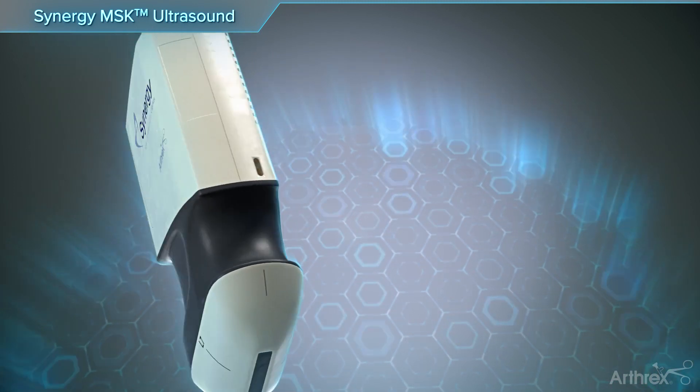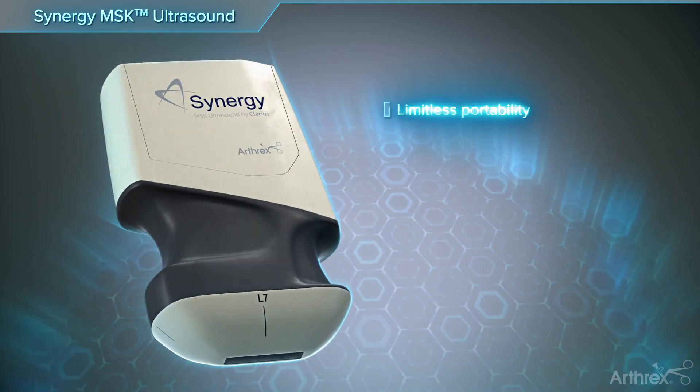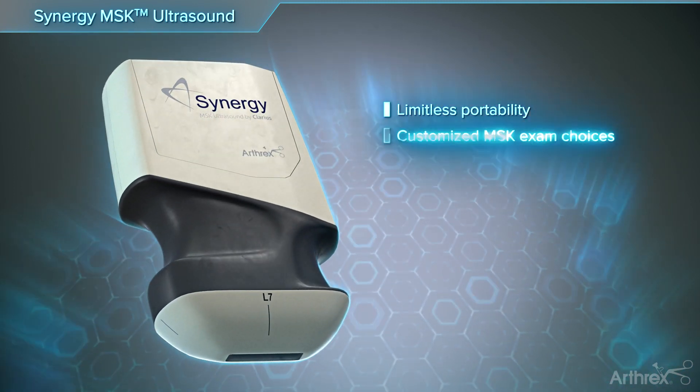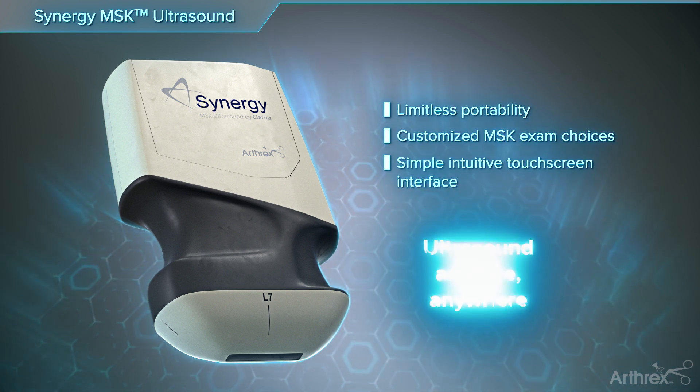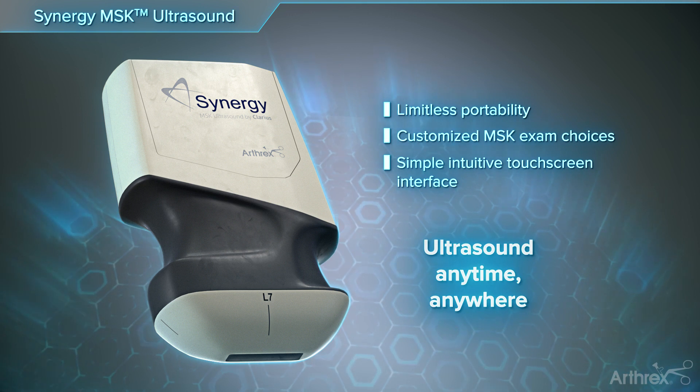The Synergy MSK Ultrasound: Limitless portability. Customized MSK exam choices. Simple, intuitive touchscreen interface. Ultrasound anytime, anywhere.